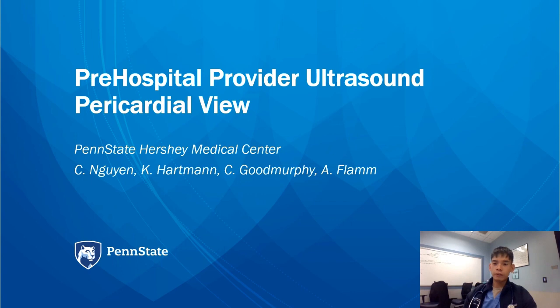Hopefully by now you've heard from Dr. Flam and Dr. Goodmurphy, both really good mentors of mine, to illustrate the importance, the versatility, and the efficiency that ultrasound machines have been used, in particular the eFAST exam, which this curriculum is all built around. And Dr. Goodmurphy has explained some basic foundations of the terminology, the knobology, and different types of artifacts that we'll see and put to use here in this module.